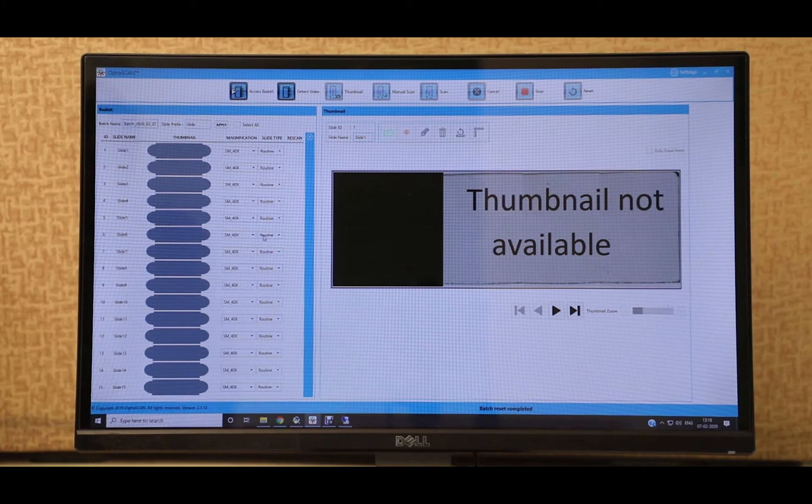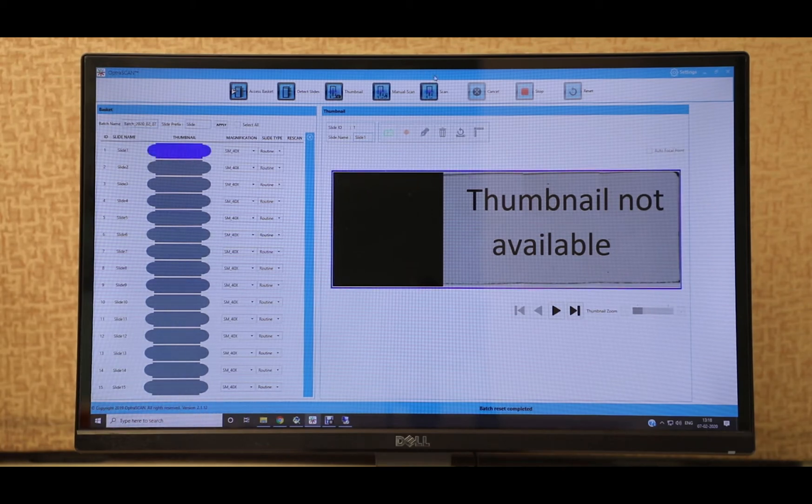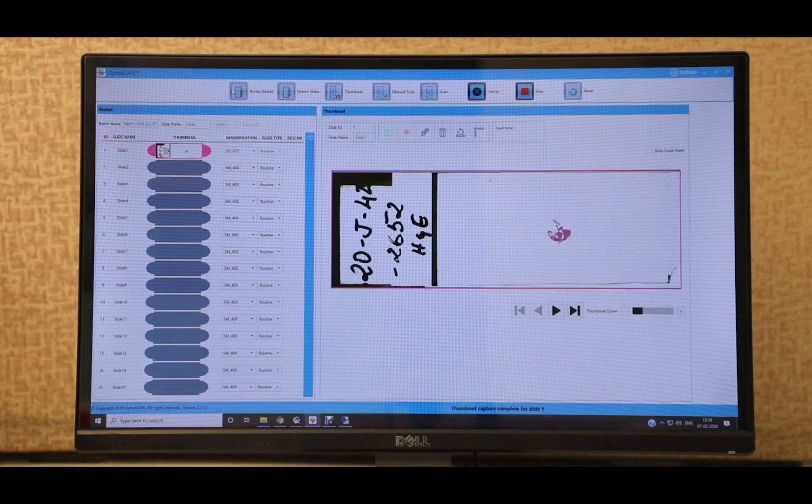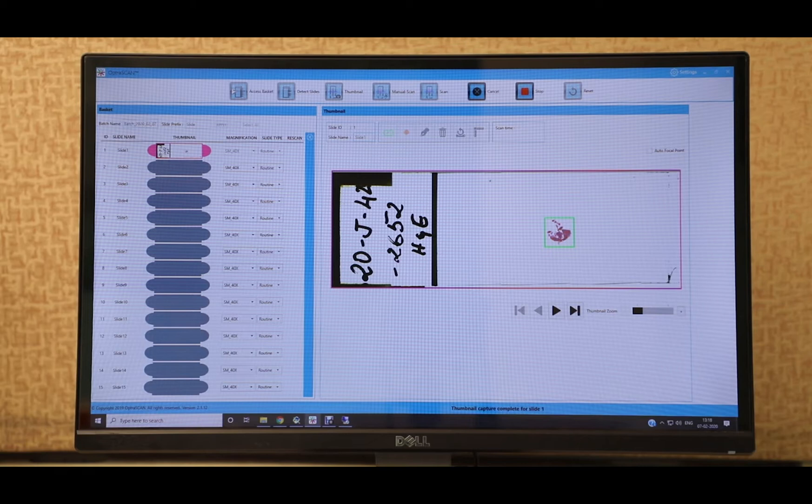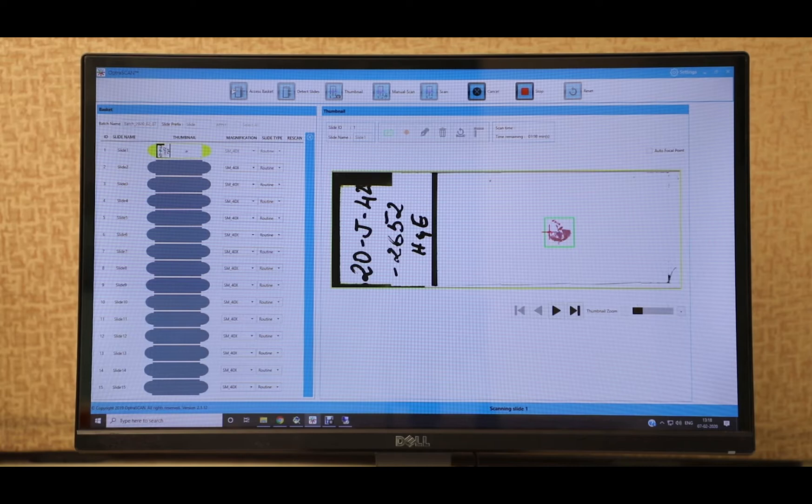We also have a desktop software where the user is provided with additional scanning features and views. The actual scanning process is divided into three stages. First, we have the pre-scan stage where a thumbnail of the slide is captured and a green bounding box is generated around the tissue sample.